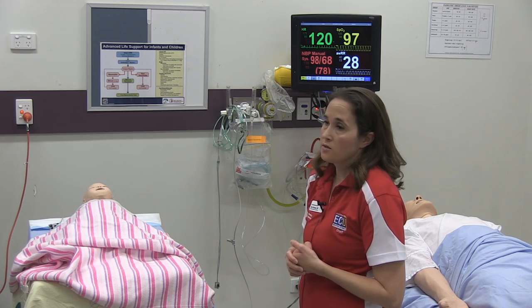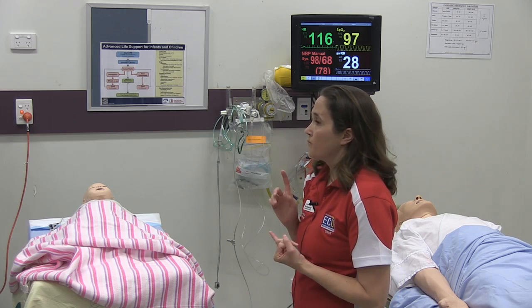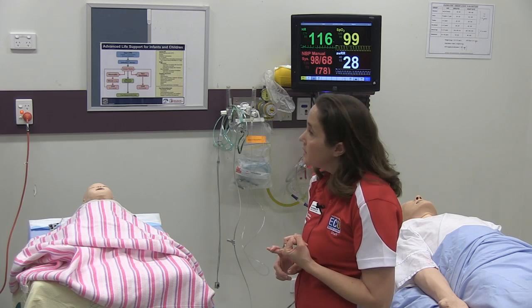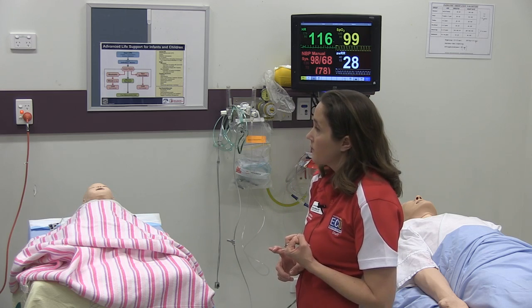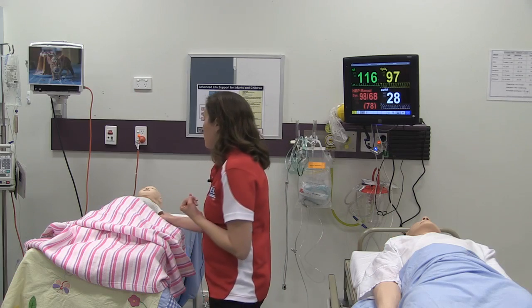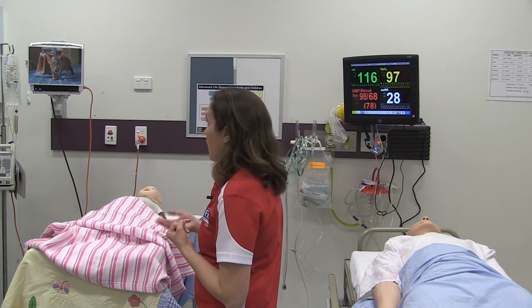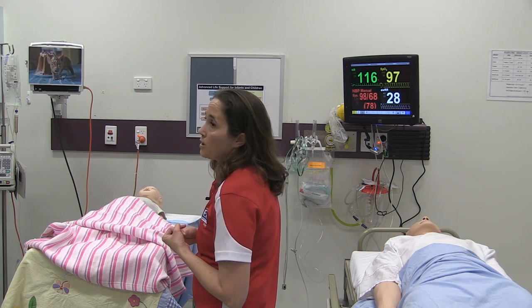The Confederate, as you'll find out a little bit later in the course as well, is meant to help facilitate any equipment needs that come up during the scenario, as well as if there's any issues as far as the mannequin, can I do this or can I not do this to the mannequin, they can help answer that so the scenario can go forward.